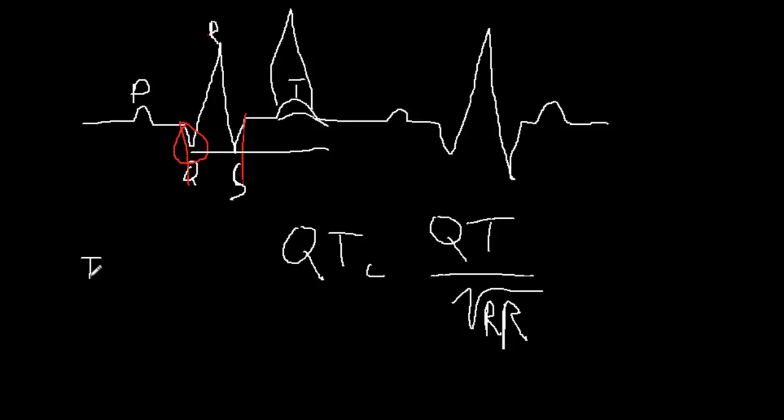I'm just going to give you the really general version of that, and that is you look at leads aVF and 1. And I like to hold up my left and right hands, and my left hand will represent lead 1. My right hand represents aVF, and I'm going to give you 4 different versions of this. So the first version is that the QRS complex is up in both lead 1 and aVF, and that means you have a normal axis.